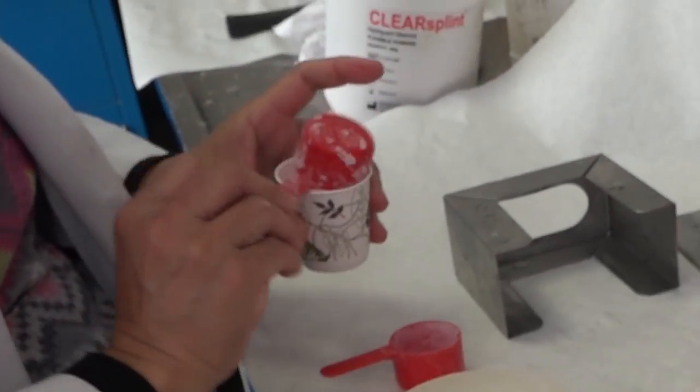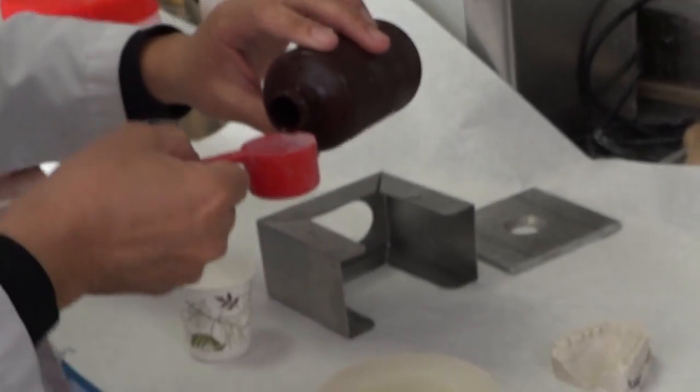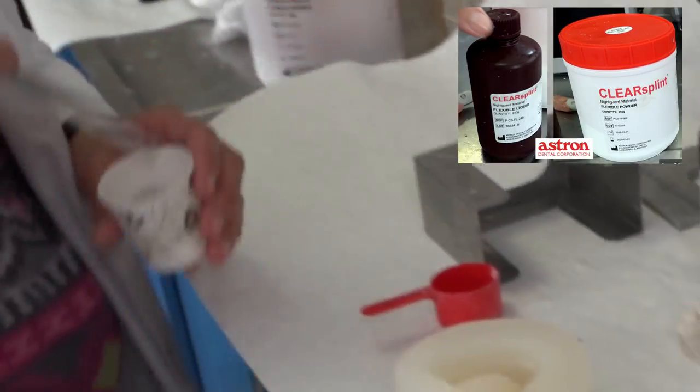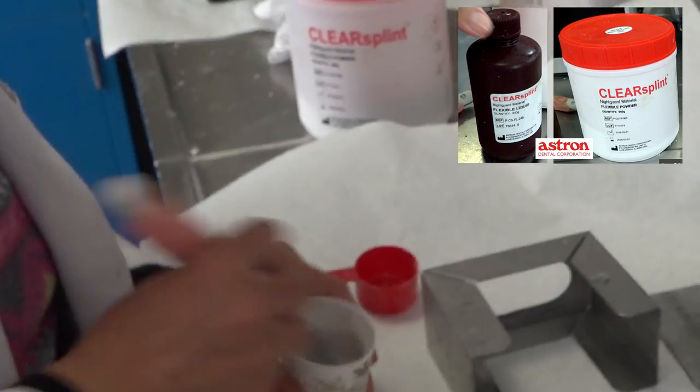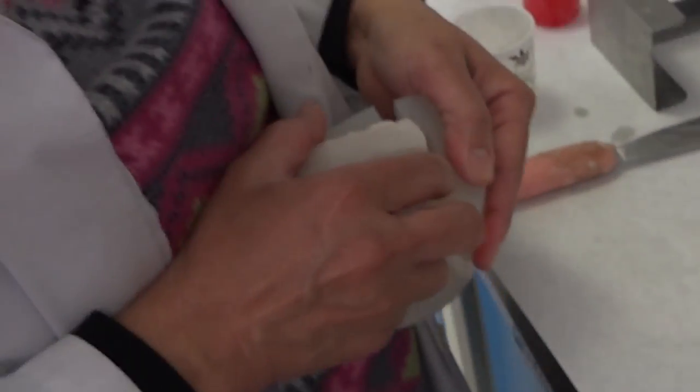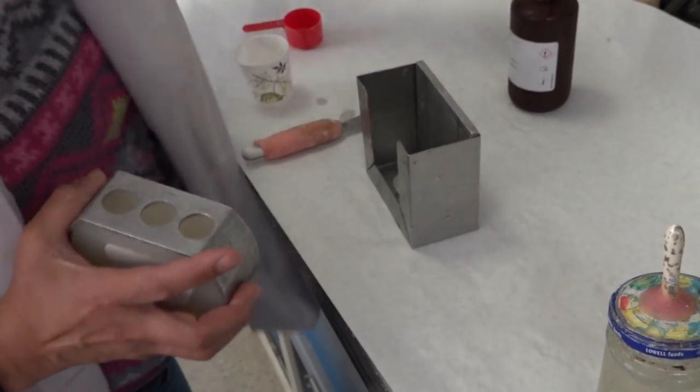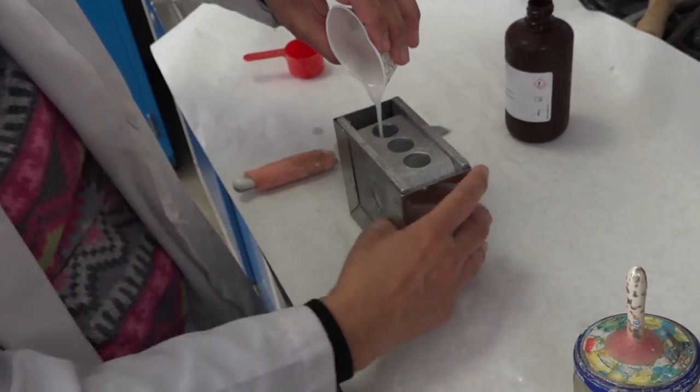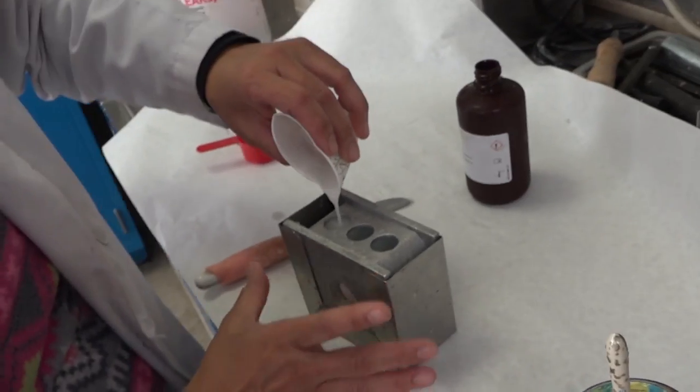Mix clear splint powder and liquid. Place model back into mold and mold back into frame. Pour clear splint into hole until it appears on the other side.